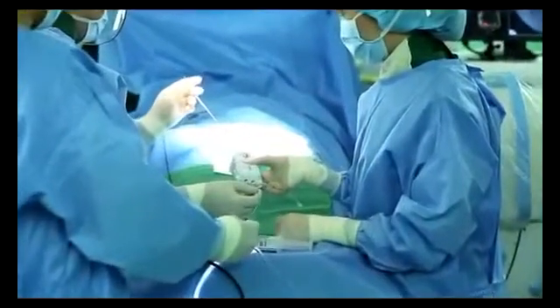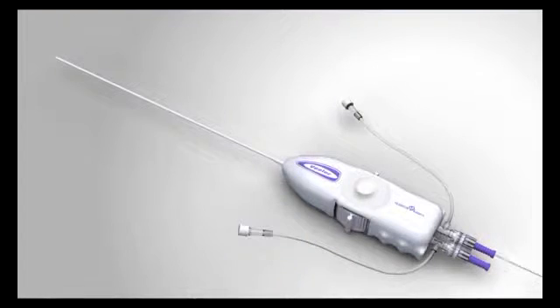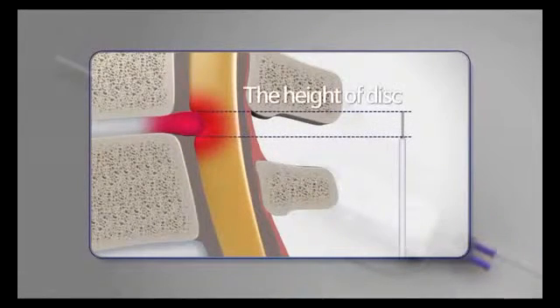It is one of the frequently asked questions. Here is the answer as follows. Before the real operation, you are requested to measure the height of the target herniated disc, which should be removed by laser, on the sagittal view of MRI. The height is the length of the laser fiber that will protrude out of the catheter.